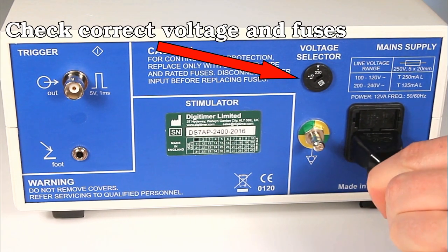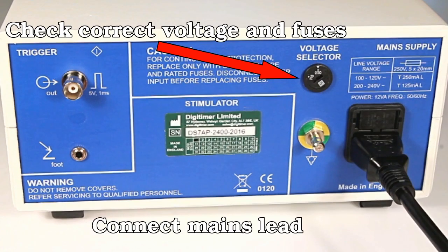Check the external fuses and voltage setting are correct for your local power supply, then connect the mains lead or power cord to the socket on the rear of the stimulator.